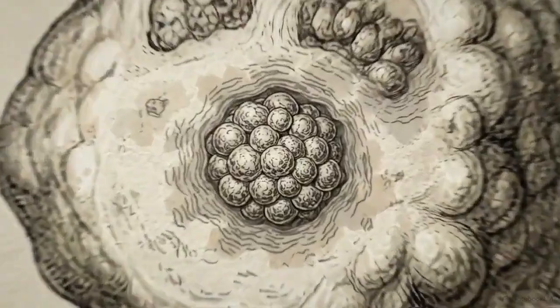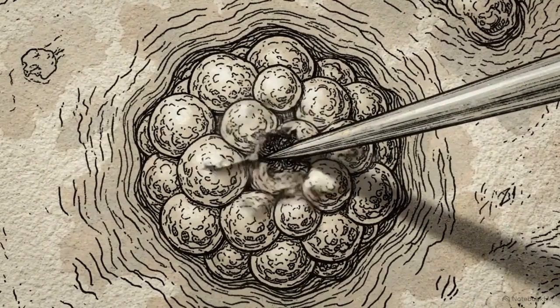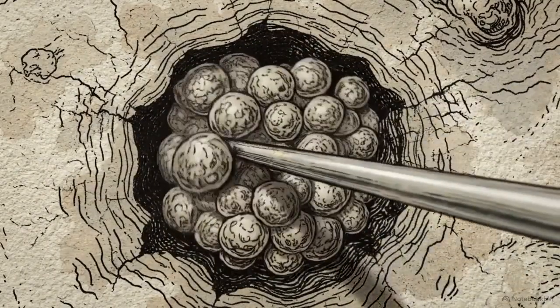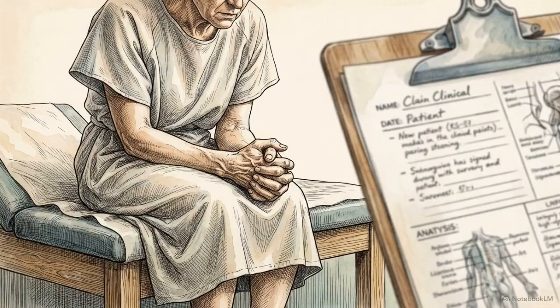In interventional oncology, a successful procedure often produces an initial follow-up scan that looks like a failure. Immediately after a tumor is destroyed, the resulting lesion typically appears larger and more prominent on imaging than the original mass. Misinterpreting this expected evolution can lead to patient anxiety and the performance of unnecessary repeat procedures.